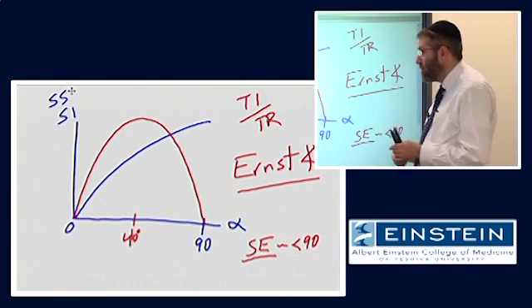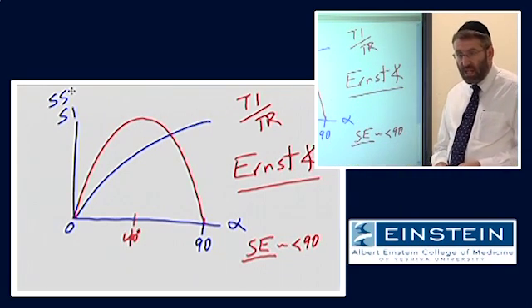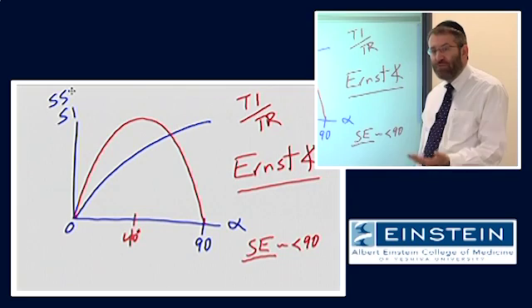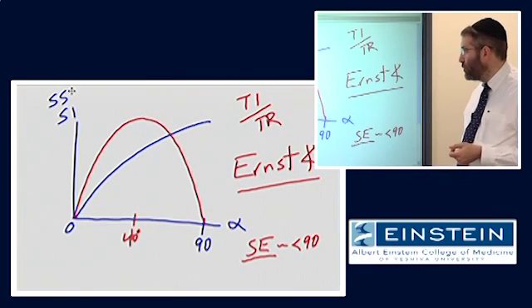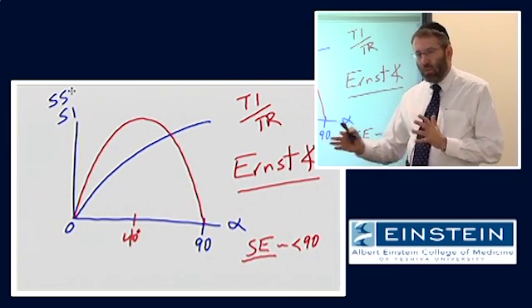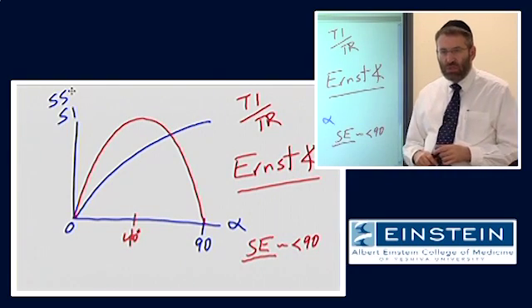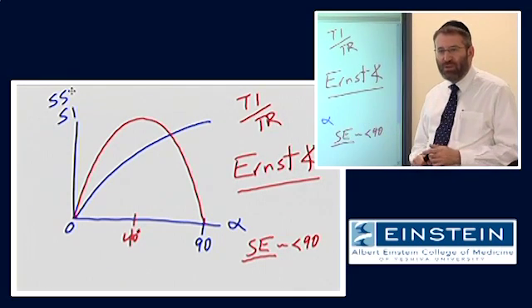But you're absolutely right. So for example, let's say you're doing musculoskeletal imaging where you have lots of fat and lots of muscle. So the T1 of fat and muscle are quite different. The Ernst angle for fat and muscle will be different. Now, in that case, we might make a choice and say, well, the T1 of fat is very short, so generally its steady state signal is always going to be higher anyway. So maybe we'll choose our Ernst angle based on tissue. So the fat water thing, that's kind of an extreme in terms of differences in T1. In general, gradations of T1, for example, between gray matter and white matter in the brain, they're not so enormous. But it's a good point. It's an observation. There's nothing we can do about it. That's the way it is.